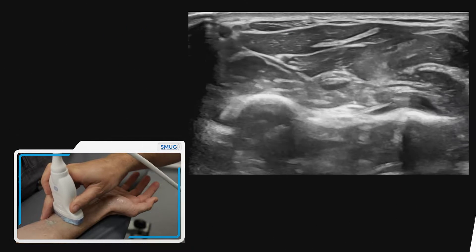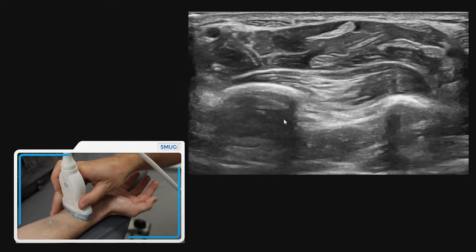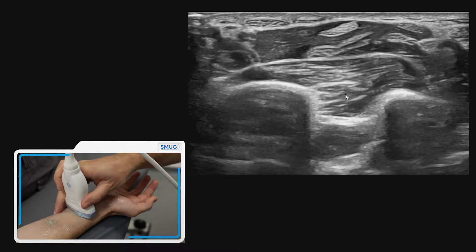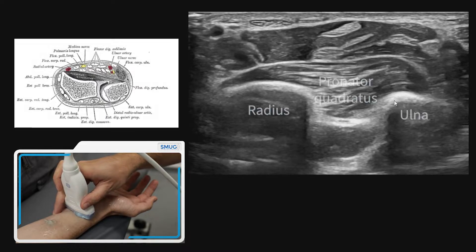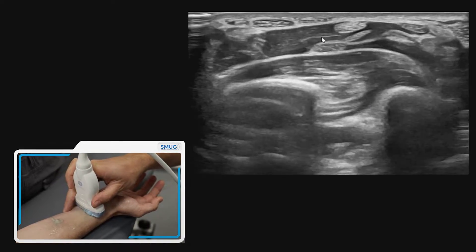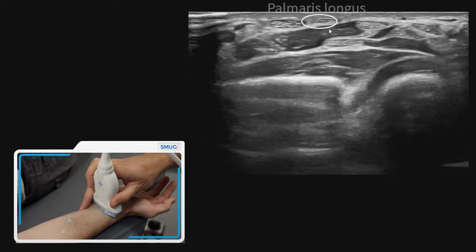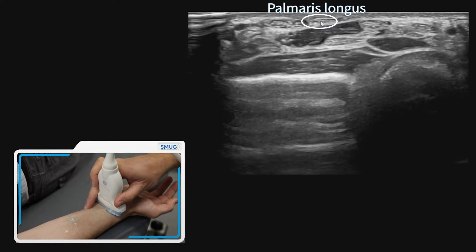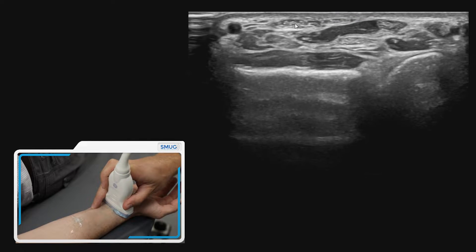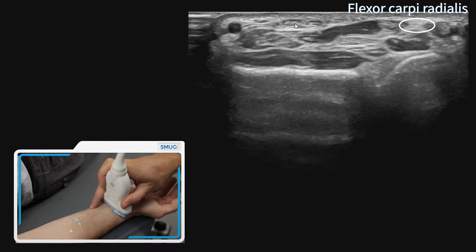To assess the flexor tendons of the wrist, the first soft tissue landmark we can identify is the pronator quadratus muscle, which sits between the radius and the ulna. Now if we look at the tendons that sit most superficially — not everybody has a palmaris longus, but we can see one here, and next to that more radially we can see flexor carpi radialis.